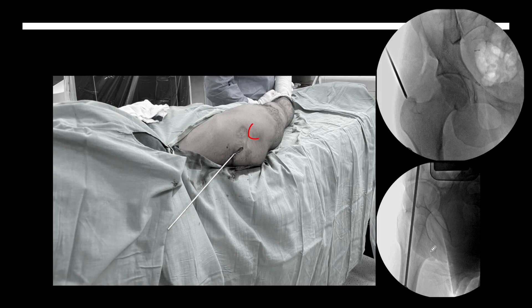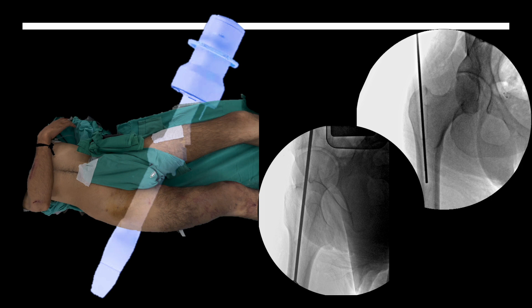So how to get this view? The emitter part of the C-arm is positioned more cephalad compared to the receiving area. The receiving area of the C-arm is lying at a lower level compared to the emitter area. By doing this, you will be able to see a view similar to the trajectory obtained for radiographs on the fracture table. A similar kind of trajectory can be obtained for the proximal femur in supine position as well — that should not be a problem at all. You get good views like this when placing the guide wire inside the canal.